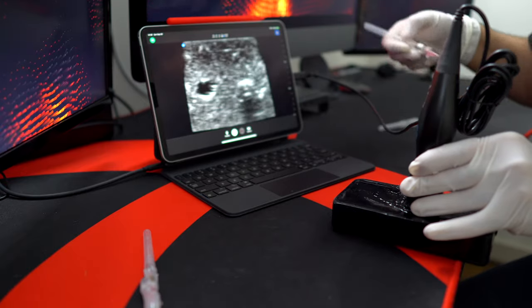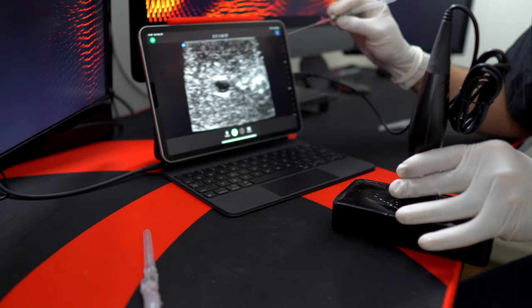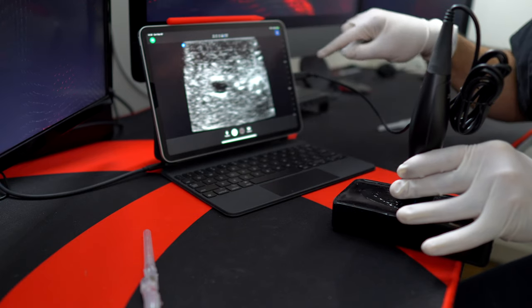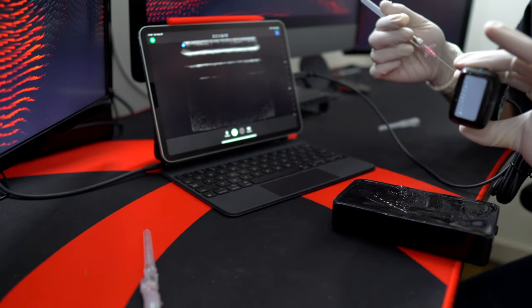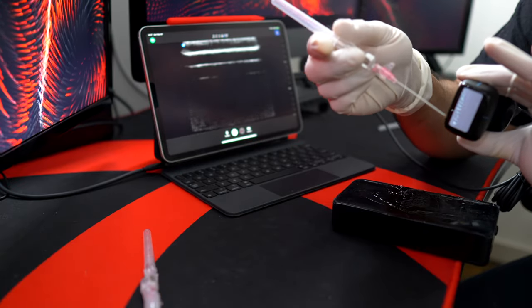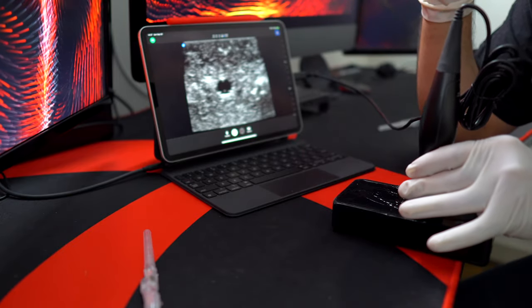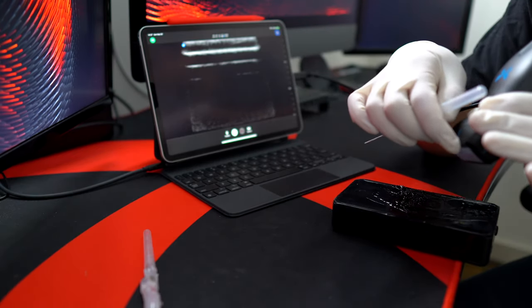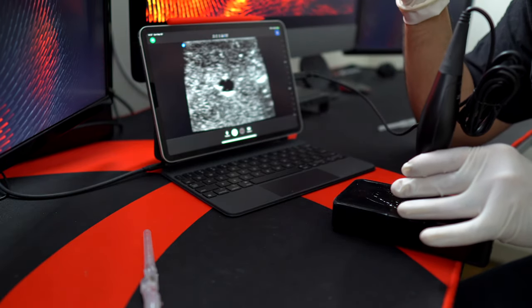Next I'm going to take this 20 gauge catheter and roughly gauge how deep my structure of interest is. In this case I'm about a centimeter and a half down based on the depth markings. That's how far you want to start away from the ultrasound probe. Remember, on the bottom of the ultrasound the beam emanates from a thin sheet in the middle — not from either end. So when people say start a centimeter and a half away if the vessel is a centimeter and a half deep, that's from the middle of the probe, meaning the needle will start right up against the edge.